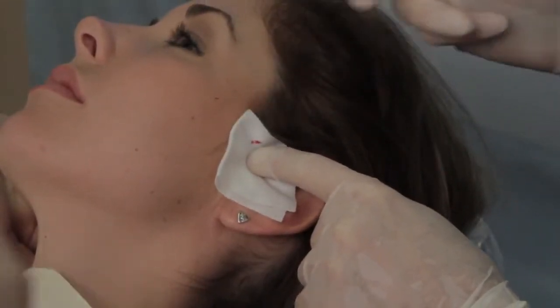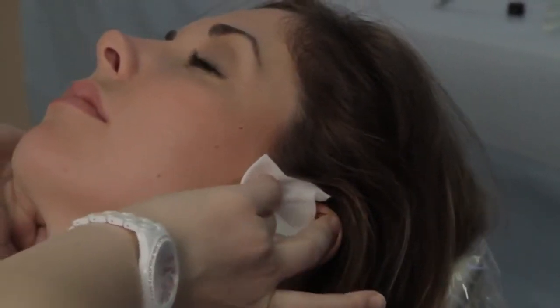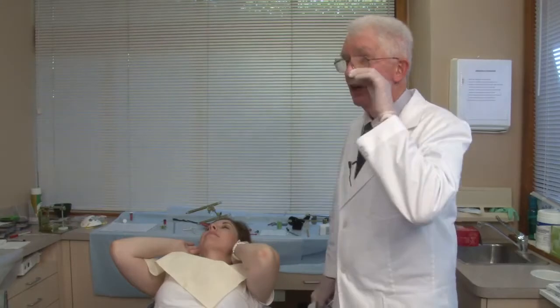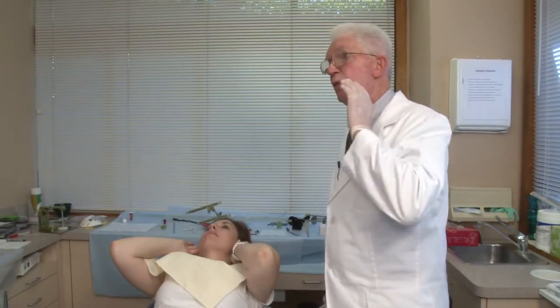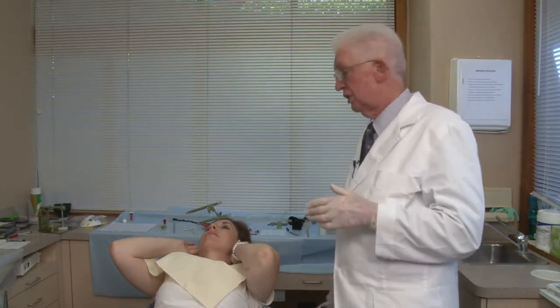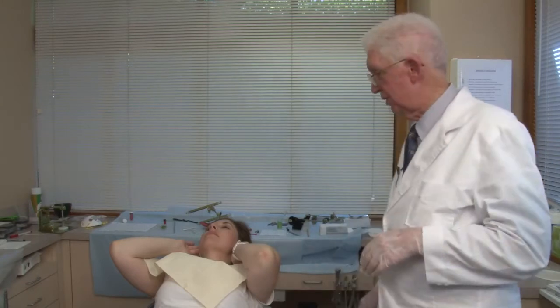Okay, now we have the patient hold pressure on that for 2 or 3 minutes, and then we tell the patient, don't wash the area because you want the skin to close over. If you wash it, you can wash the dye out. So we don't want the patient washing or anything for a couple hours or so.